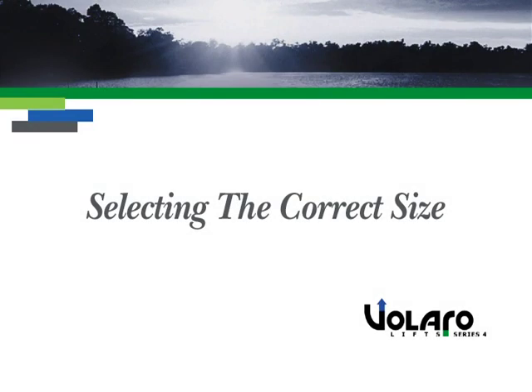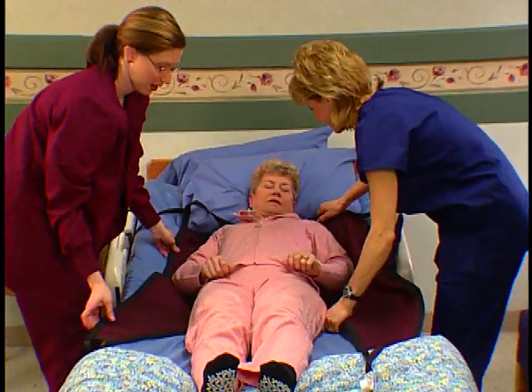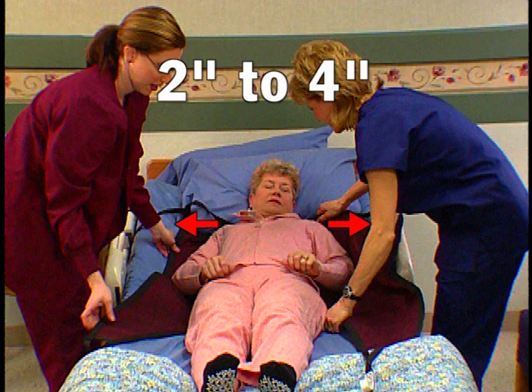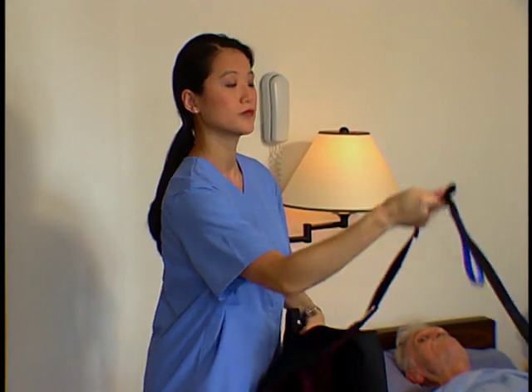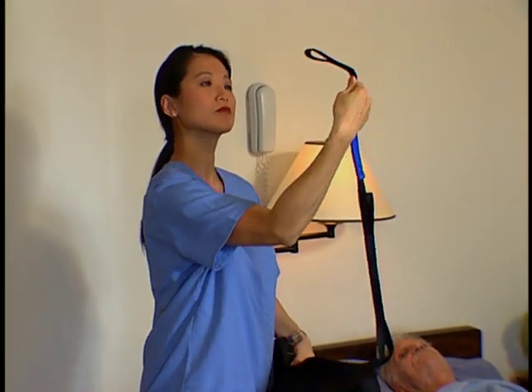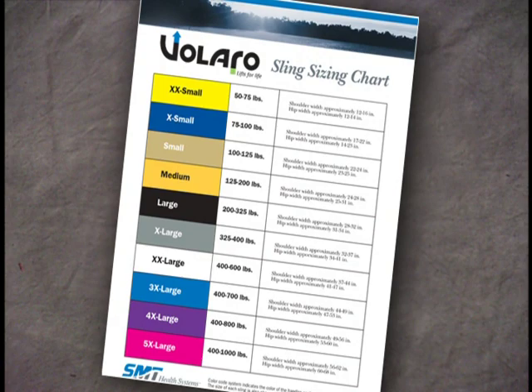Selecting the correct size. To select the right size sling for your patient, make sure there are approximately 2 to 4 inches of material protruding past the patient's shoulders. Volaro lift slings come in many sizes to accommodate almost any person. All slings have color-coded handles for ease of size identification. Please see the sizing chart provided by SMT for color references.